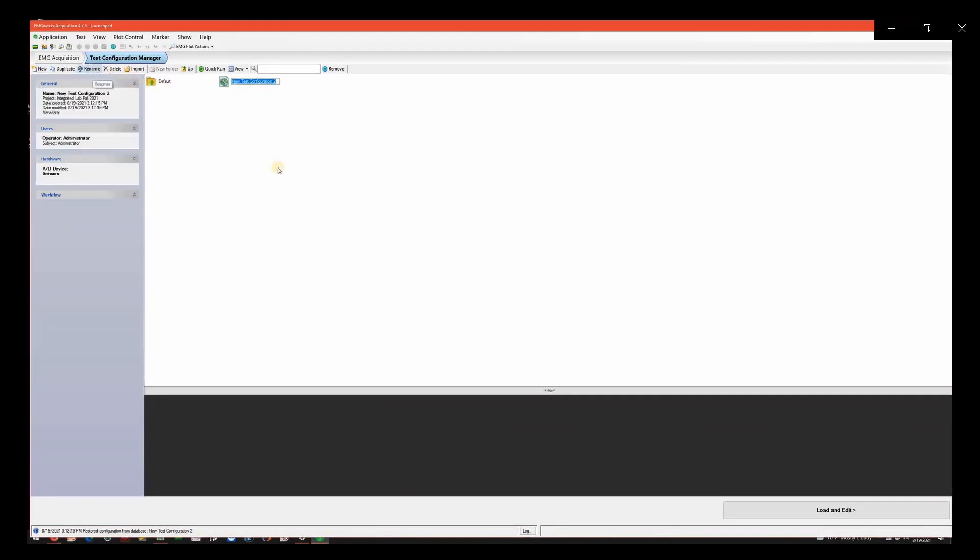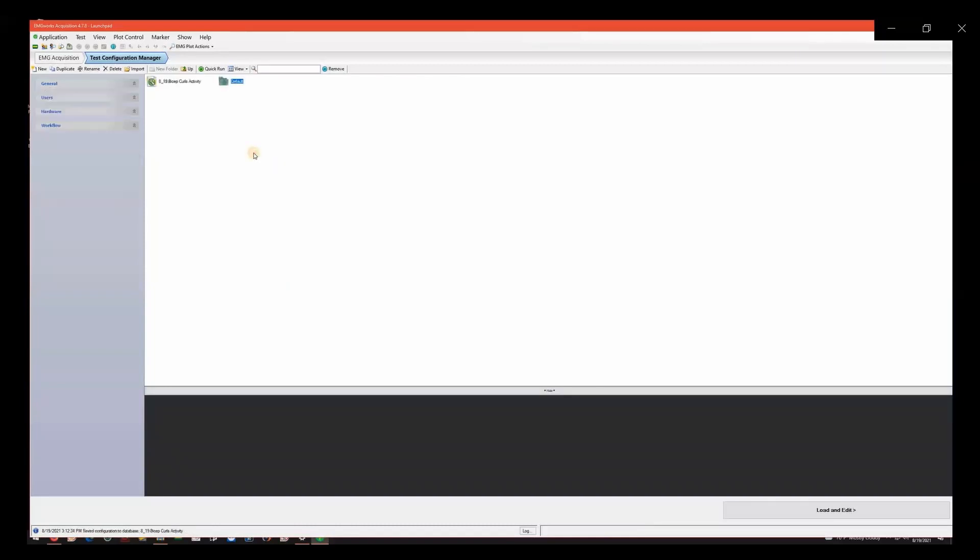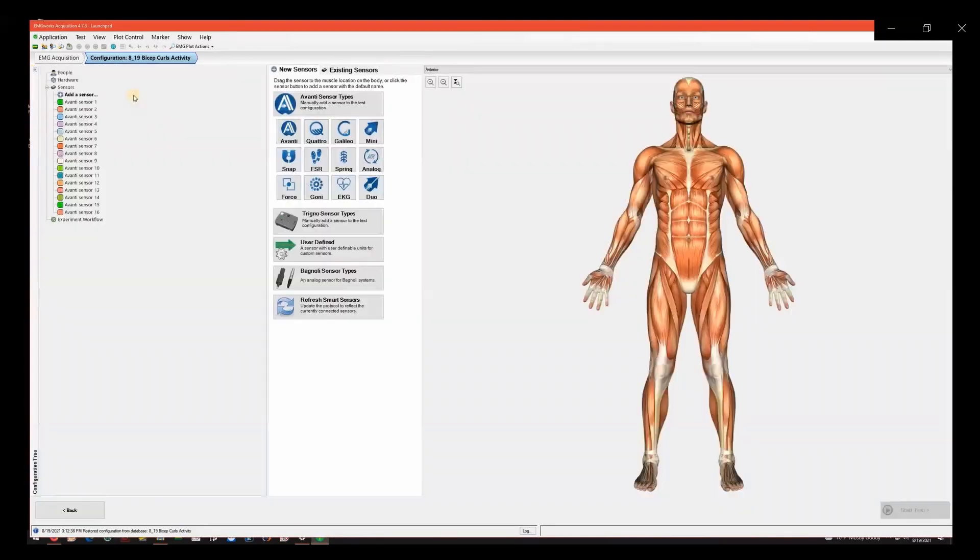Rename the test configuration file based on the date and activity. For this example, we named it 800-19 Bicep Curls. Double-click on your file to enter it. You will be working your way down the tree of options on the left-hand side of the screen. Start at People.